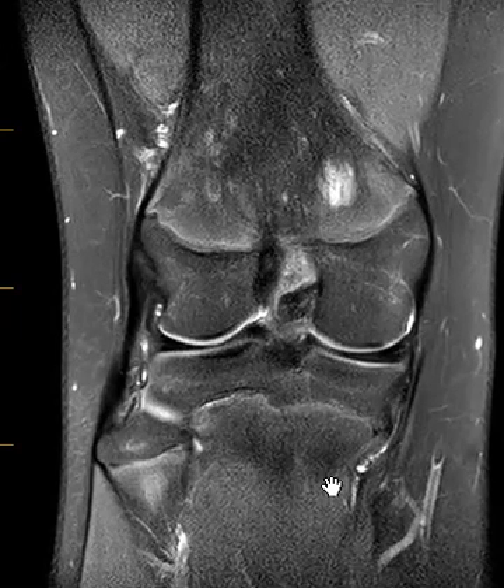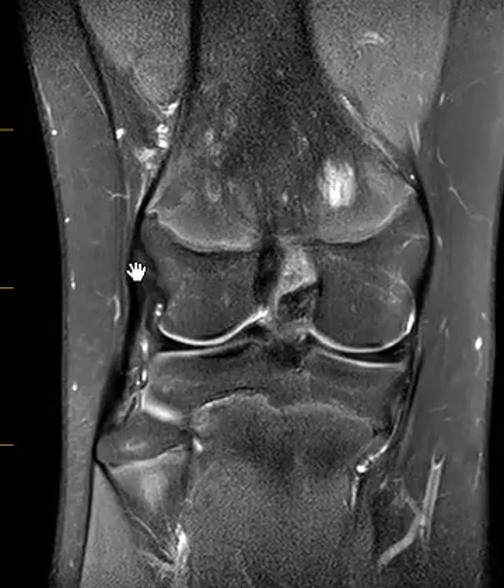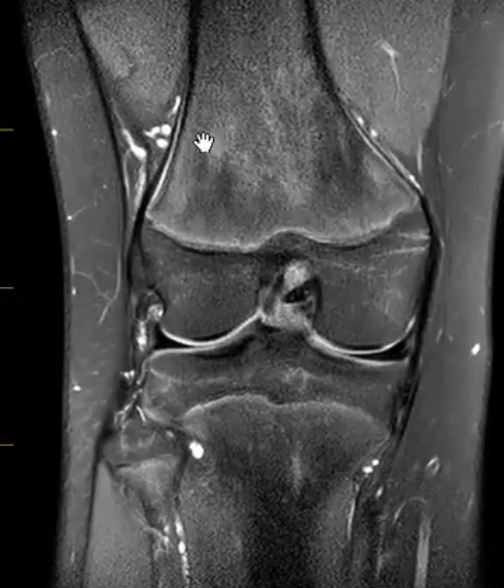Hello, this is Dr. Gay from First Lake MRI. This is a normal patient and they have a ligament down here on the outside called the fibular collateral ligament that comes off the lateral side of the femur.